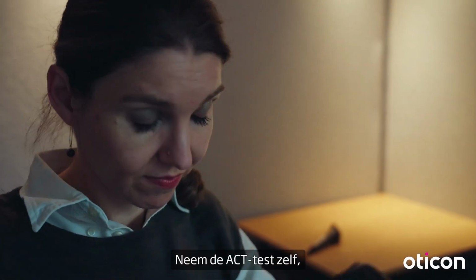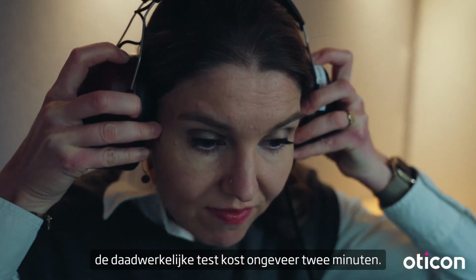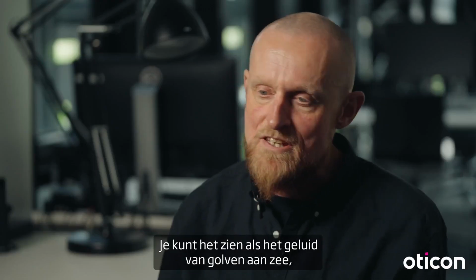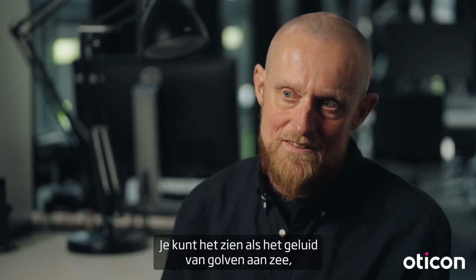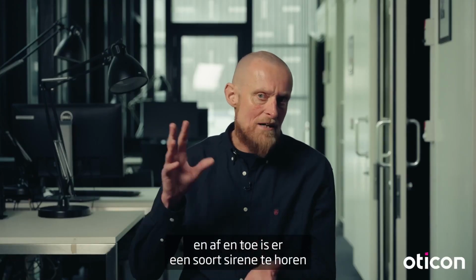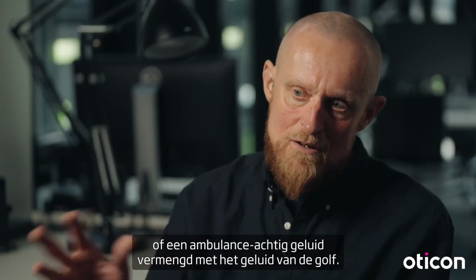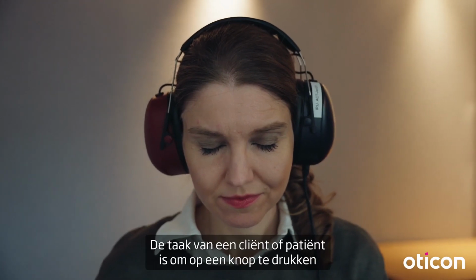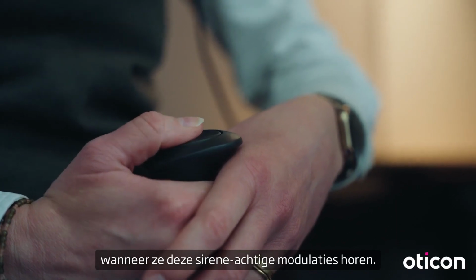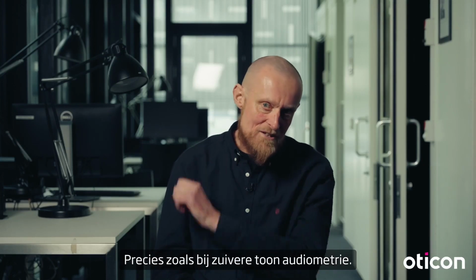Doing the ACT test in itself, so the actual test run, takes on average 2 minutes, and then of course there's a little bit of instruction. You can think of it as the sound of waves at the seaside, and then every now and then there's a siren-like sound or an ambulance-like sound blended into the sound of the waves, and the task of the client or the patient is to press the response button whenever these siren-like modulations are heard. Just like in pure tone audiometry? Exactly as in pure tone audiometry.